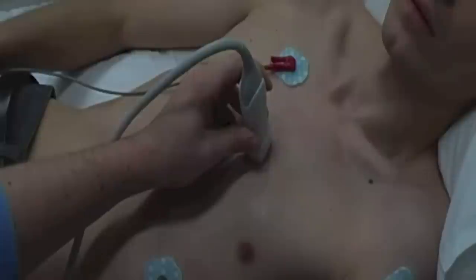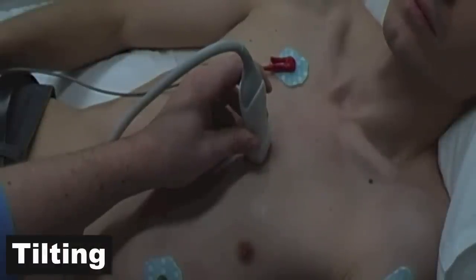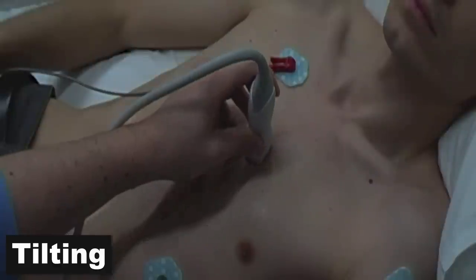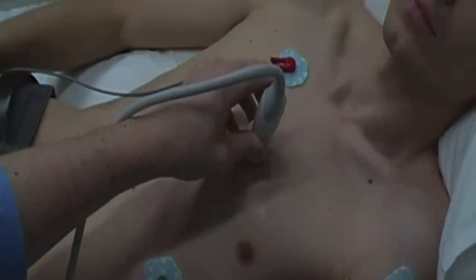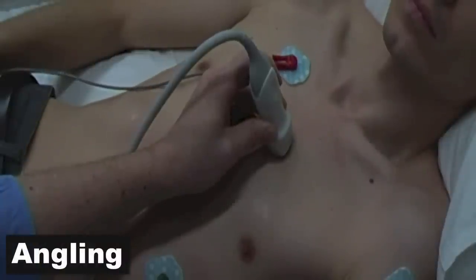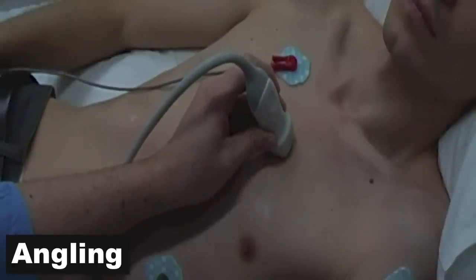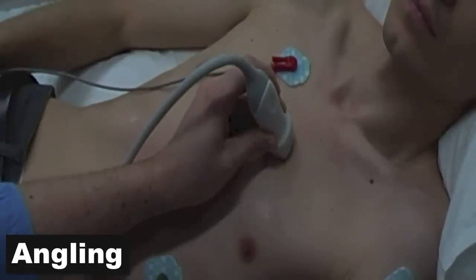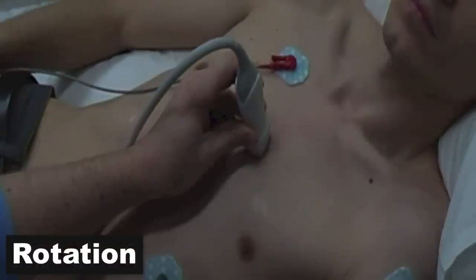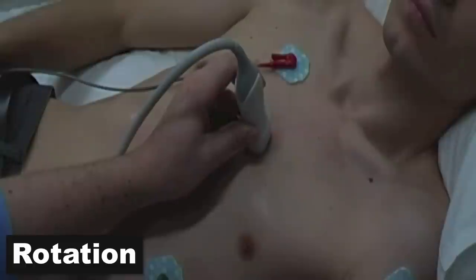Before we begin, it's important to understand the movements of the probe. Tilting the probe is moving the tail up and down through the longitudinal plane. Angling the probe is moving the tail across the short plane of the probe. Rotating the probe is either rotating in a clockwise or anti-clockwise direction.